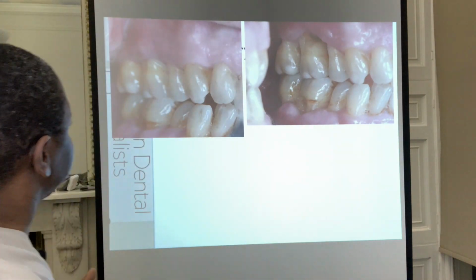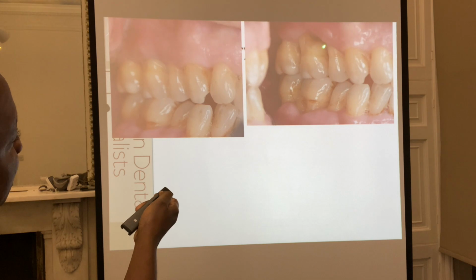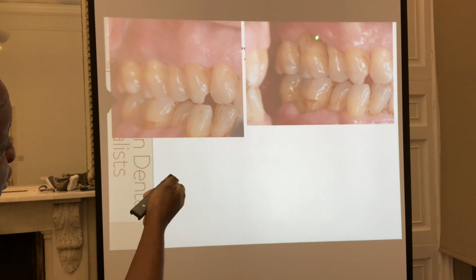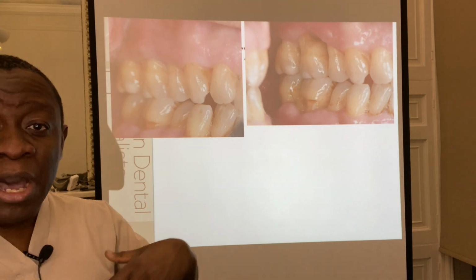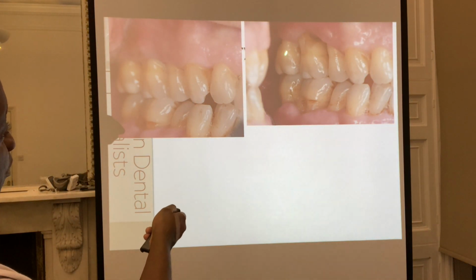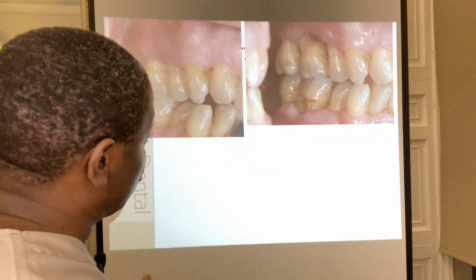So on the right side, this is what these teeth look like at the start, and this is what these teeth look like at the end. And so what are we looking at? The main thing here is, you can see that one of the roots is missing, and there's a hole in here that does not exist at the start. That's because I did some gum surgery and removed one of the roots here to allow the pocket to become 4 millimeters or less. And again, on the upper right side, I removed one of the roots on that last tooth for the same reason.